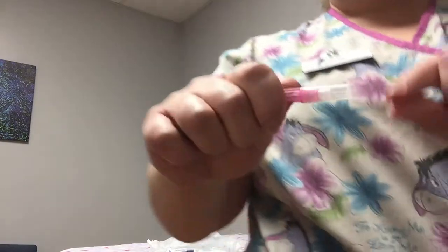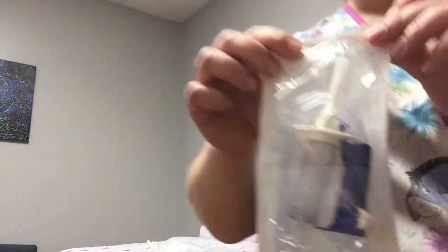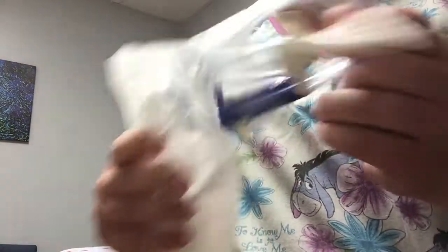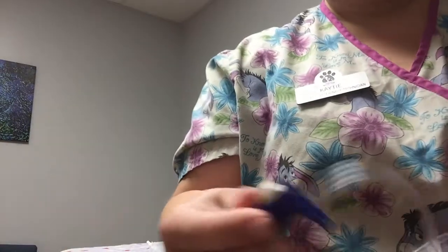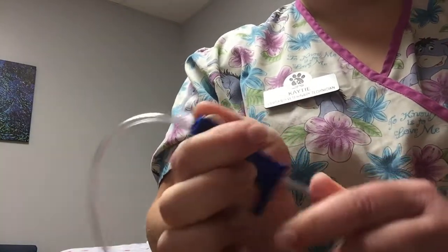When you open the needle, twist and it comes apart. To open this brand of lines, these peel apart. There's a little strip holding that together — peel that off. There's another strip — peel that off. I always start by rolling the clamp down because that closes off the line so you don't end up with any leaks.